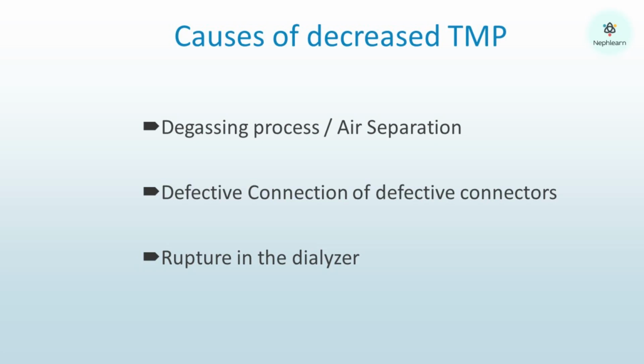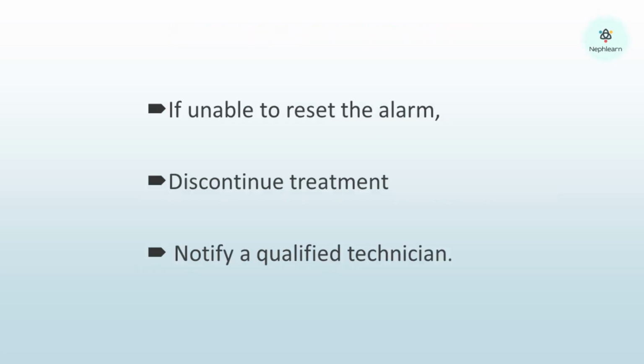Reduced TMP may be because of degassing procedure, defective connections, and ruptured dialyzer. If you are unable to reset the alarm, discontinue the treatment and notify the technician.